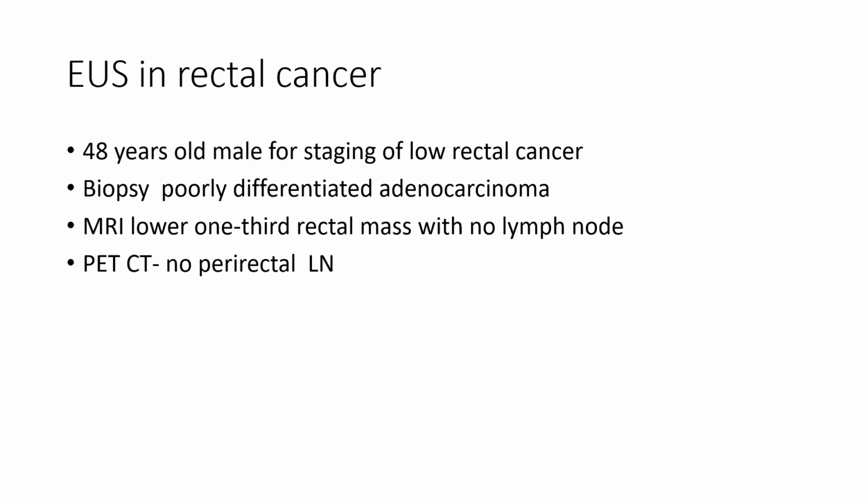So when we came to gastric cancer, I divided gastric cancer into early gastric cancer and advanced gastric cancer. I gave my arguments and reasons as to why we should do early gastric cancer staging and why we should do advanced gastric cancer staging.